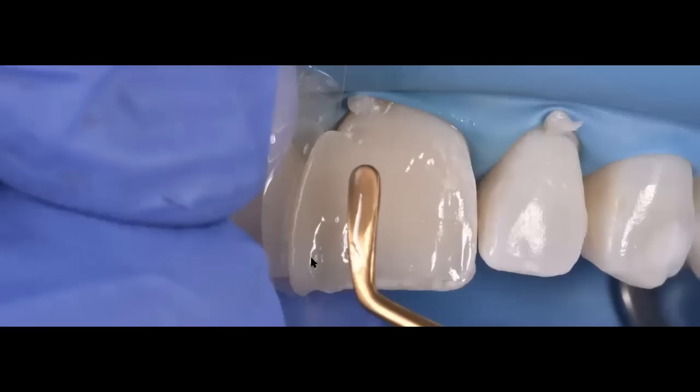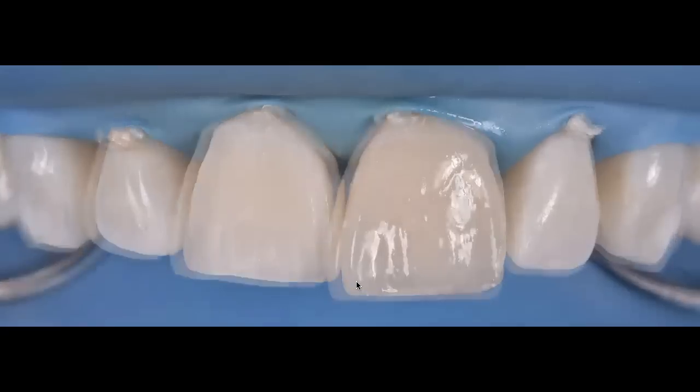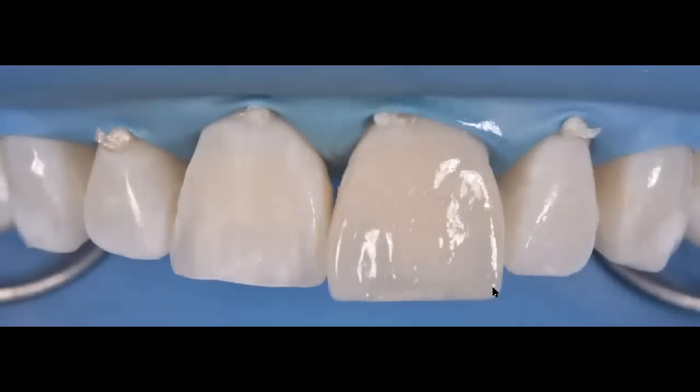I'm now only using enamel shade, a high value enamel shade, and I'm going to apply it against my Mylar strip. I'm going to pull my Mylar strip, and the whole idea is for you to develop your line angle. And now I have a well-developed and uniform mesial line angle. I'm going to go ahead and do the same thing on the distal. You can see here that I've now achieved a distal line angle, and these have all been pre-cured.